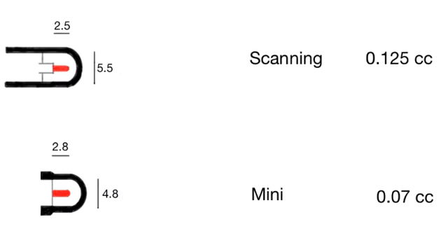So you have, for example, what I'm calling the scanning chamber and the mini chamber. As you'll see in a minute, these are used to scan across a beam. And the main reason you can do that with these is the active volumes are much smaller for these. But of course, the signal is smaller as well, so that's the trade-off.